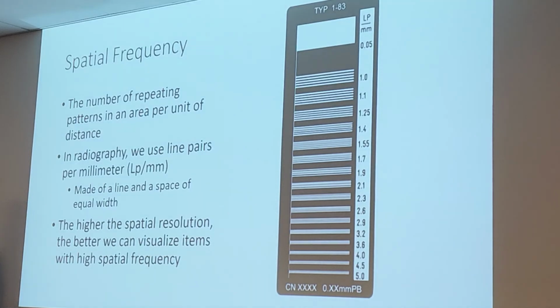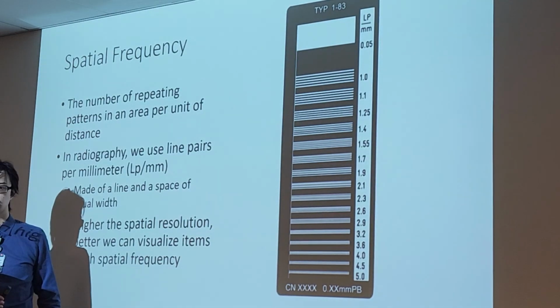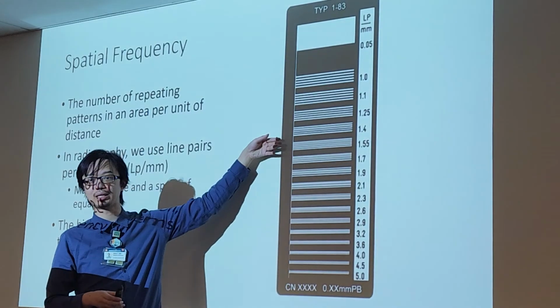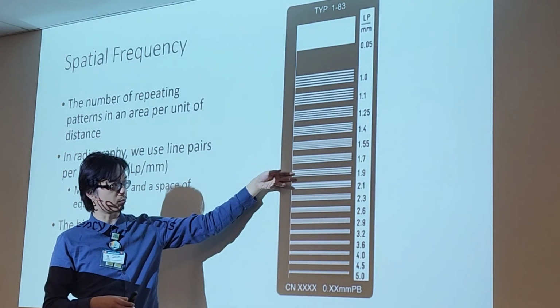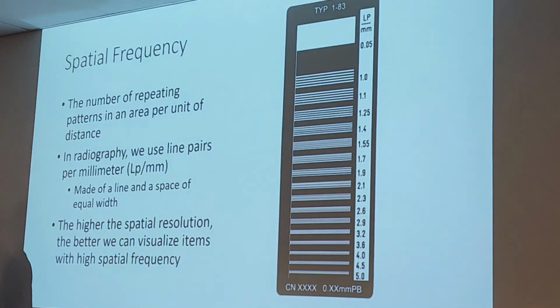Does that mean that at 1.55, if the pixels get smaller, then you'll be able to see thinner lines? Yes, if in this image we could make the pixels even smaller, then we would be able to see even thinner detail, even thinner lines. Correct. Good.